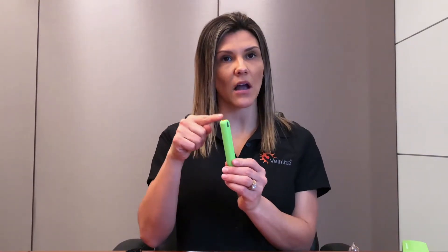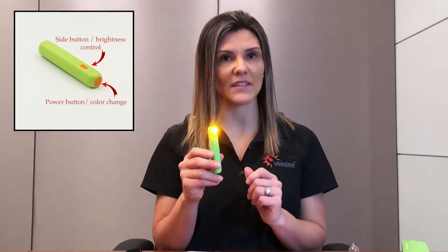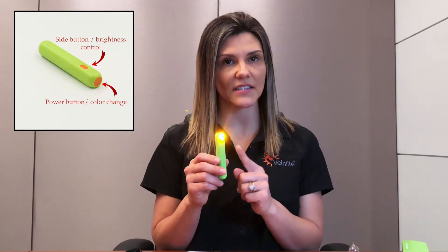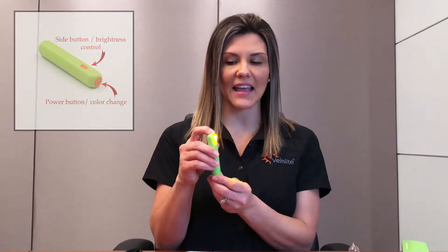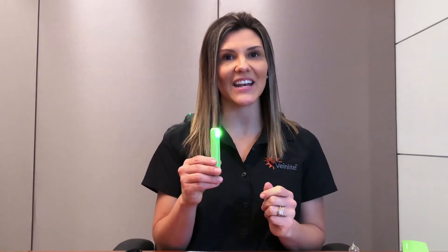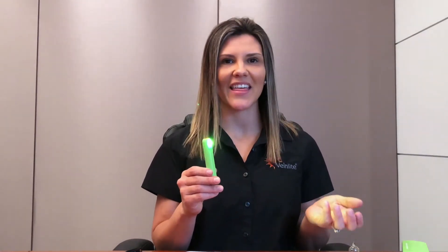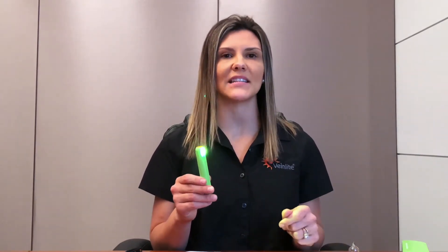To turn on the Veinlight Neo, press the top button located on the unit. This button will cycle through our three colored LEDs. The first is our orange LED used to find veins. The second is our patented green LED that has been proven to find arteries. To visualize the difference between the two, the vein will appear as a dark line and the artery will be a faint red line in which you'll be able to see pulsating.